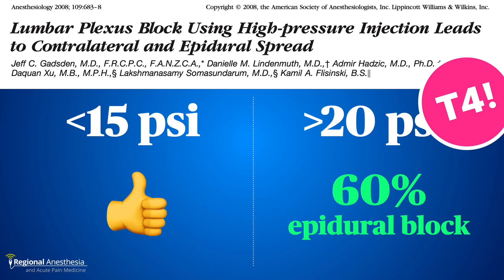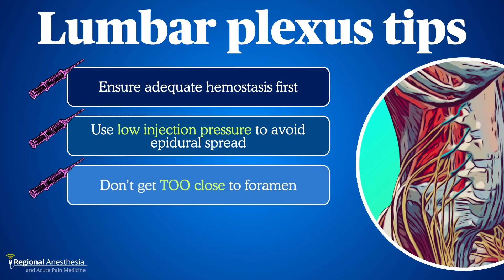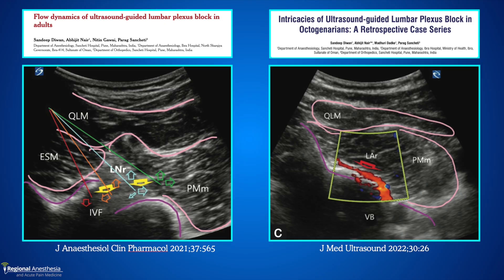Aim for low and slow when it comes to injection pressure and speed. Be careful about aiming your needle too medial toward the foramen — the dural cuff of the nerve roots extends several millimeters after leaving the spine, and it's possible to place a needle tip within this cuff if you're too medial. It doesn't take much local anesthetic there to quickly cause a total spinal, and there have been cases of fatal subarachnoid spread with this mechanism. Injection too close to the foramen also promotes epidural spread, so stay near the center of the muscle. There are also big lumbar arteries near the vertebral foramen — another reason to steer clear.